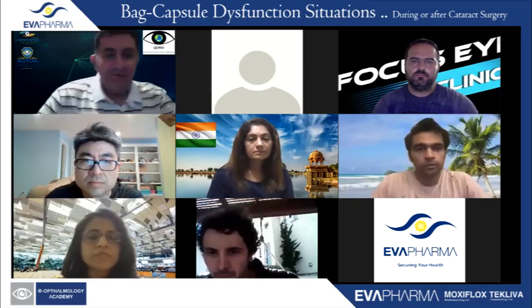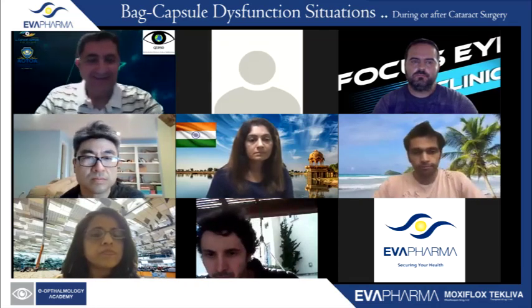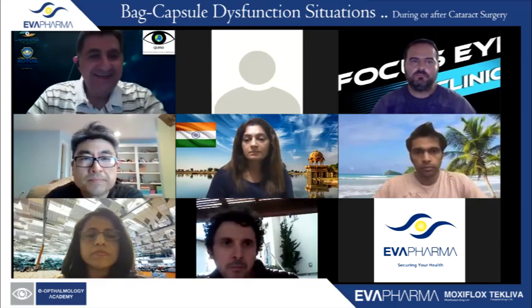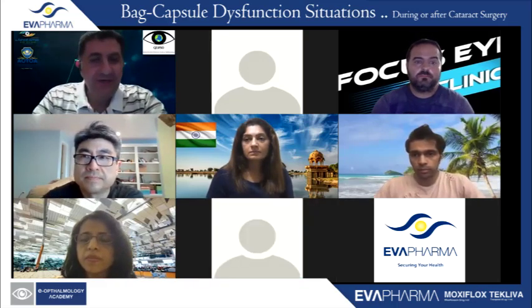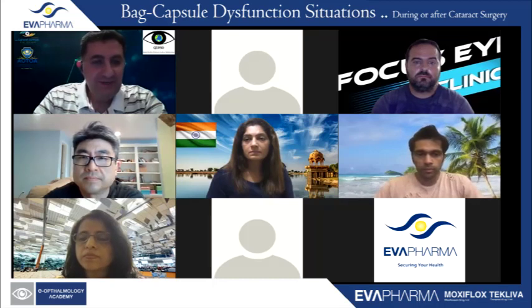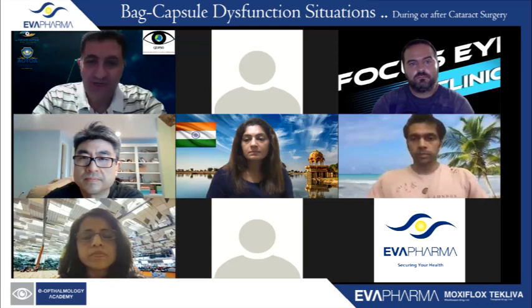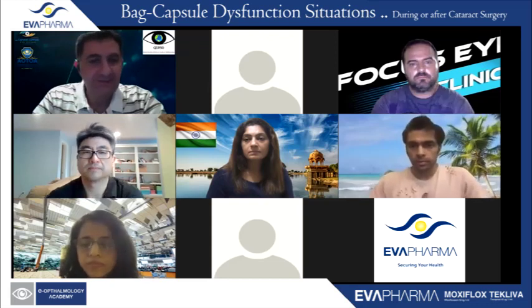Perfect. Thank you. We should move to the second speaker. Now, Lukan, show us how, if you have a torn bag or you are going to remove the bag, you are going to do an iris fixation IOL in the absence of the capsule.